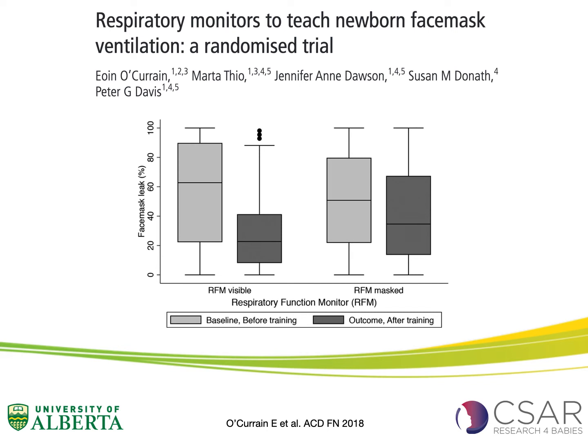Also, what is quite interesting is that when you teach neonatal resuscitation and use a respiratory function monitor during teaching, you will be able to reduce your mask leak quite significantly, as you can see, which is a great achievement. So when you train mask ventilation using a respiratory function monitor, you will be able to reduce the mask leak. So you assume you have a better mask ventilation performance, but as I showed you earlier, in the clinical trials, unfortunately, the same isn't true for clinical trials.